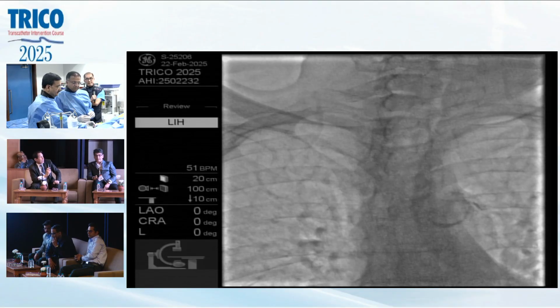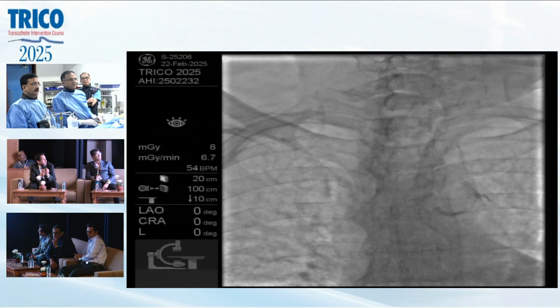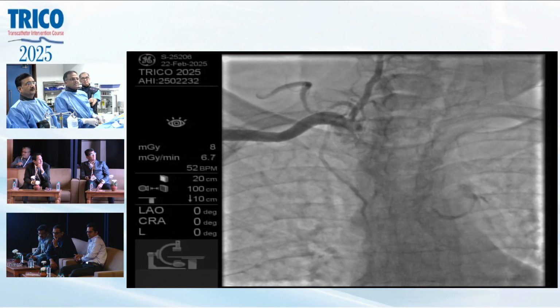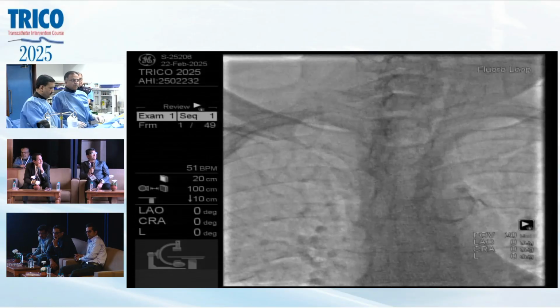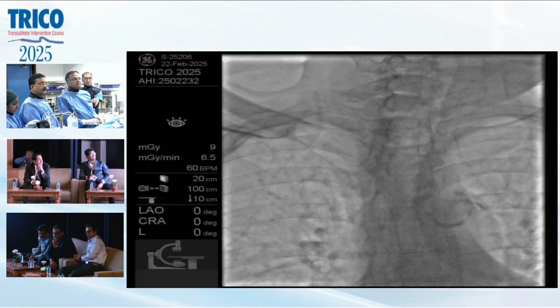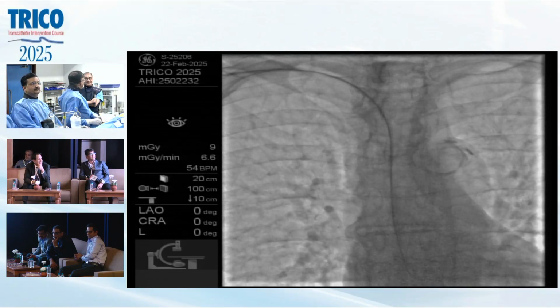While you do that, it's a pretty interesting case. Seventeen years ago, it was a bare metal stent in the LAD. Yeah, it looks like a complex lesion, especially in the caudal view. Okay, take a shot. So it's just going out a branch. This should go up there.